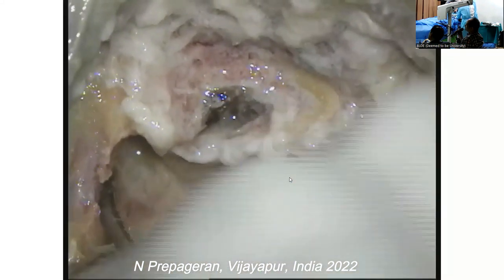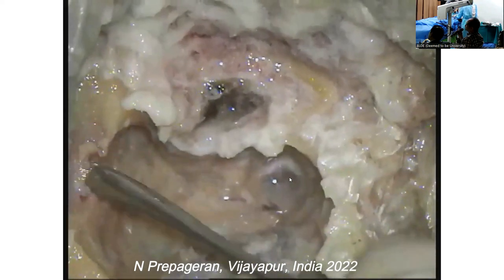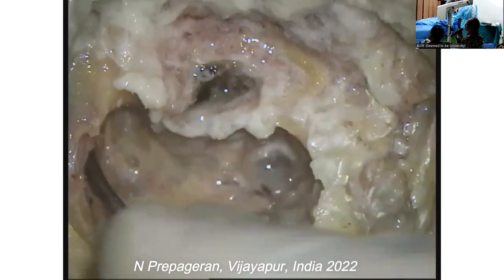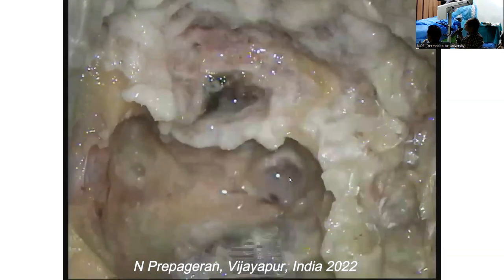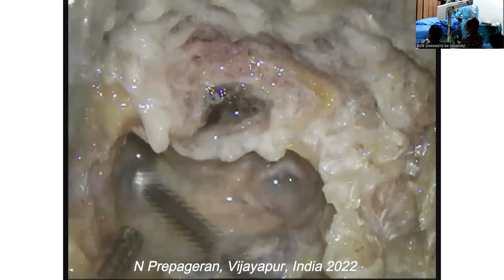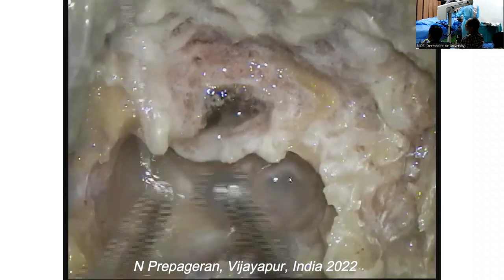So with this now, this is the exposure that I will give my neurosurgeons if we are doing a fifth nerve schwannoma. It drains into the transverse sinus. Okay, this is then the sigmoid sinus. See, middle cranial fossa. Expose all the way up. Yes, so, drill again. So now we can drill down here very nicely. But tomorrow, if you guys want, I'll show you all the bleeding from the sigmoid sinus, jugular bulb, or I can show you all the surgical approaches in real life for posterior cranial fossa for lateral skull base surgery. And then I show you cochlear implant.